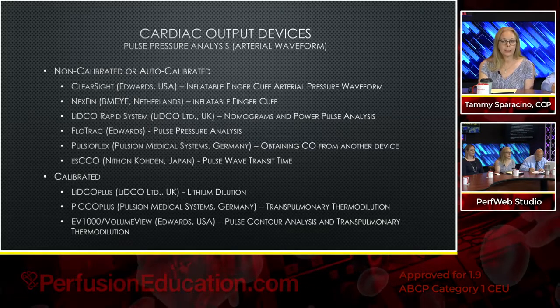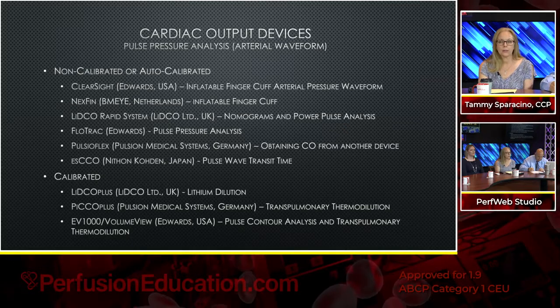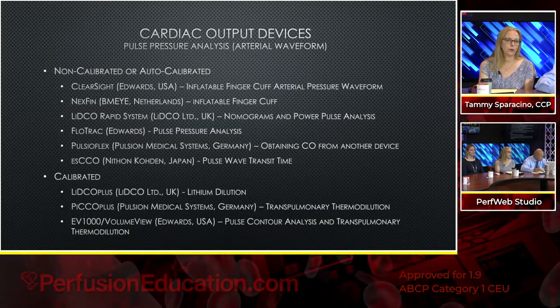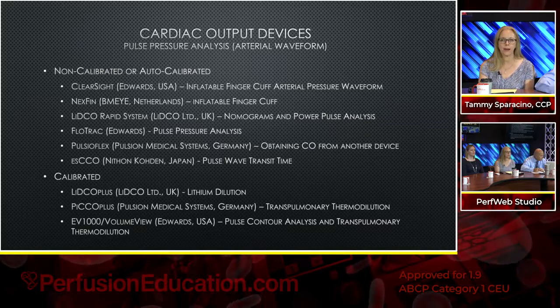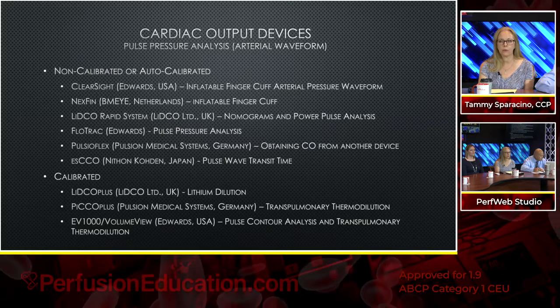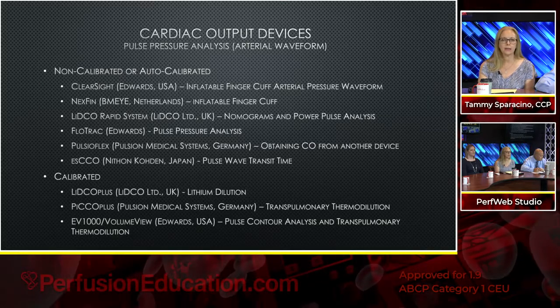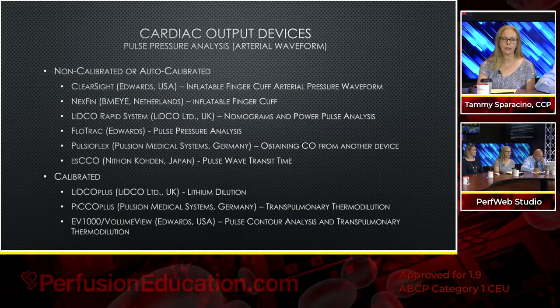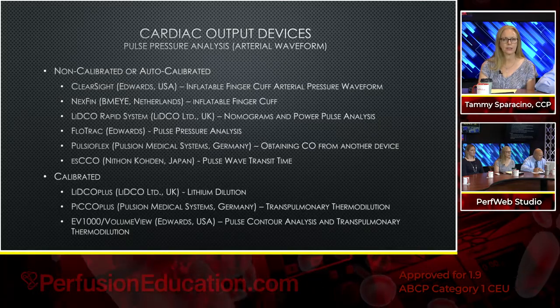Then you have your LiDCO rapid system, and it's using pulse power analysis, and you're putting in the parameters of your patient, age, weight, and those kinds of things to help it fine-tune a little bit. Then you have your FloTrac from Edwards, which is a pulse pressure analysis again, and it is mildly invasive. Actually, that's not true.